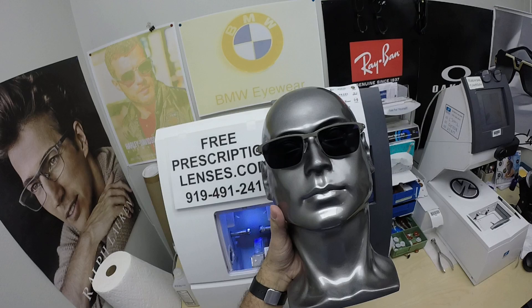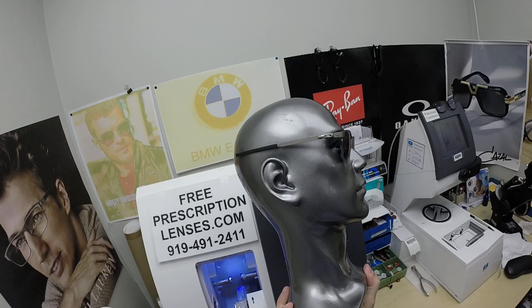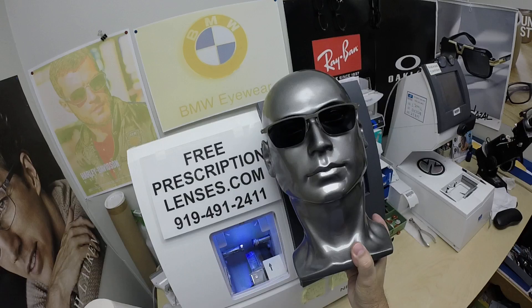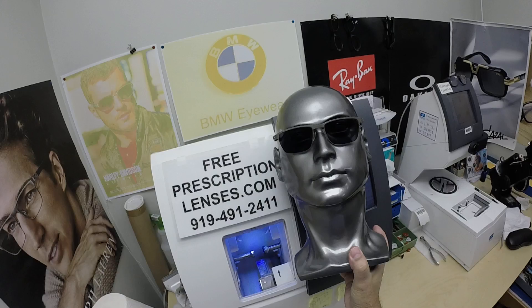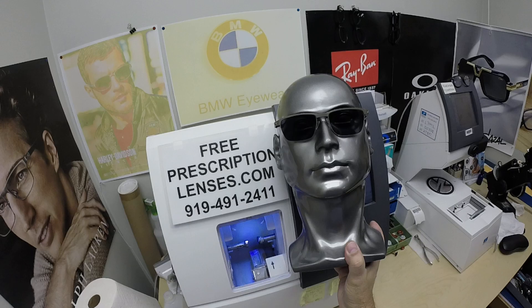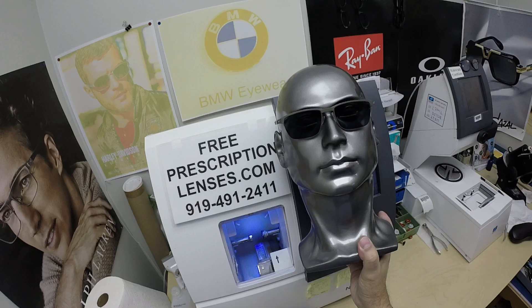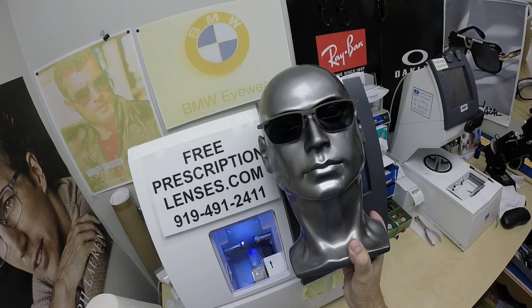The only time they won't work perfectly is if you're behind the windshield of a car. Your windshield absorbs the sun's harmful ultraviolet rays — that would cause your dashboard to crack from sitting in the sun all day — and that's why they don't get 100% dark behind a windshield. These new Photo Fusion X Edition from Zeiss will get up to 30% dark behind a windshield. They are also temperature sensitive, meaning they will get darker when it's 80°F or below than when it's 90°F and above.